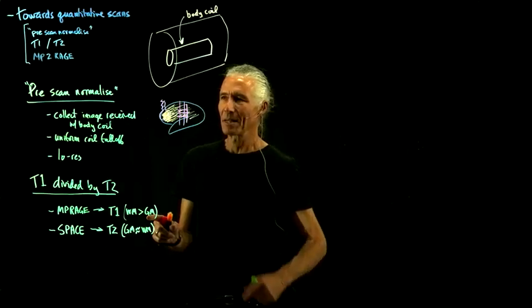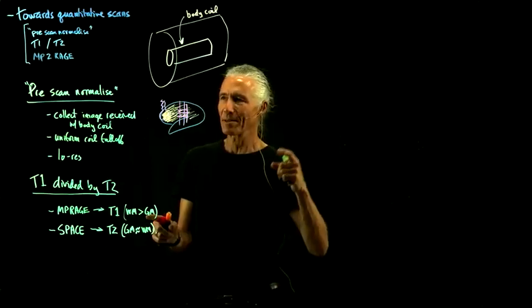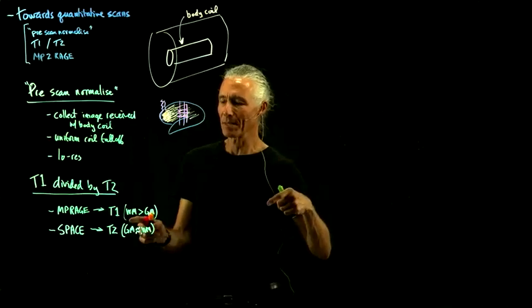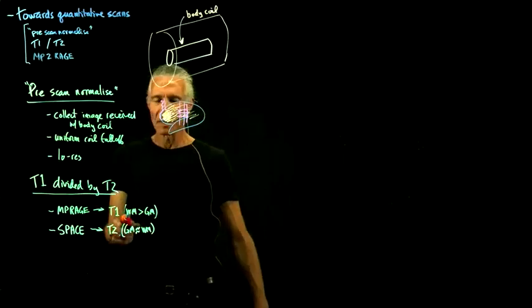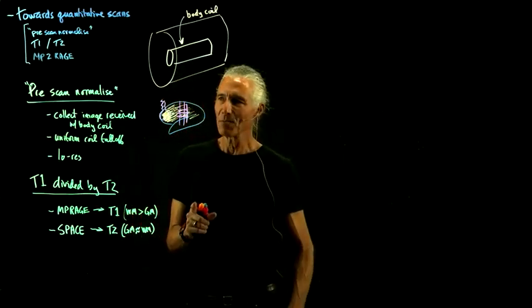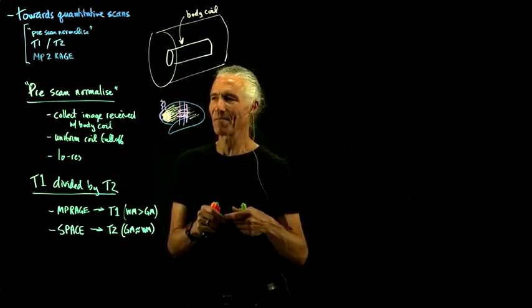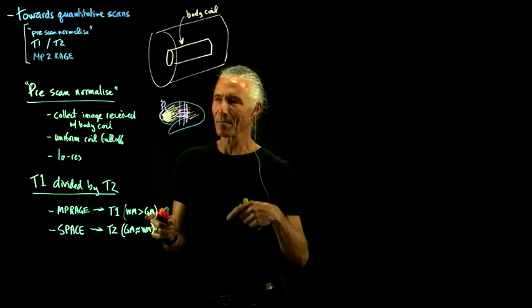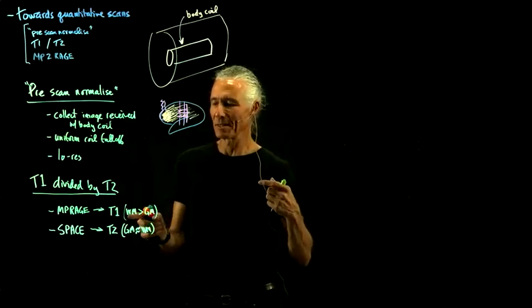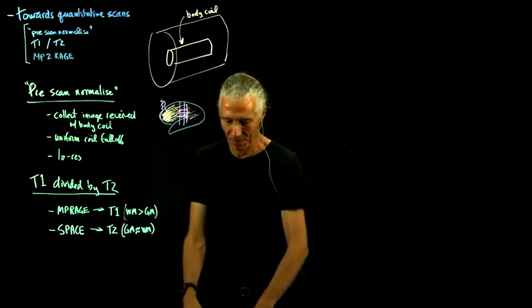So if you did it in terms of T1, gray matter has a higher T1, but it's dimmer because white matter had faster recovery, and so you got more signal. So a T1 weighted image is actually an inversely T1 weighted image. If you actually looked at it, the gray matter number for T1 should be higher than the white matter number for T1.